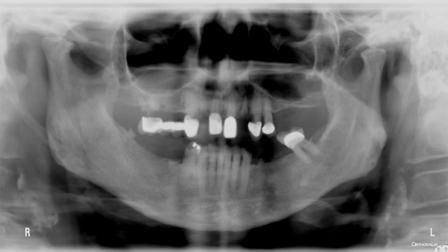Hi everyone! You're looking at a panoramic radiograph of a 71-year-old patient. When you look at this radiograph, there are a lot of things we can discuss, but today, if you look over to this side of the radiograph, you can see these opacities here and here. We can also see somewhat similar, perhaps slightly different, radio-opacities on this side of the radiograph as well.